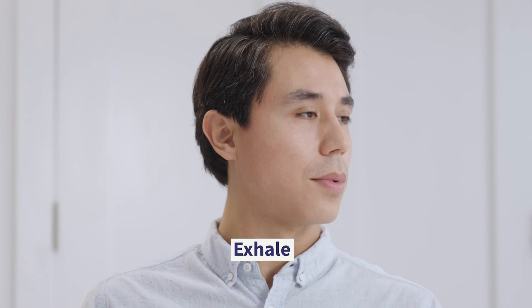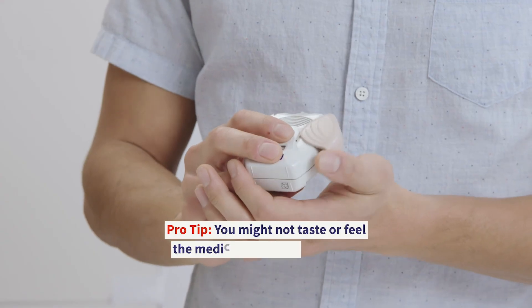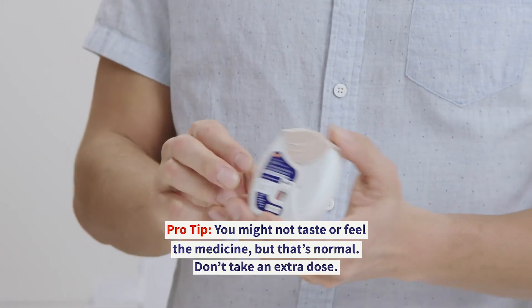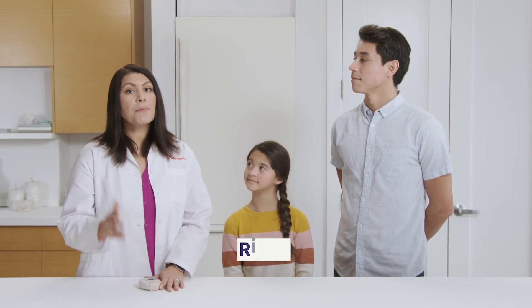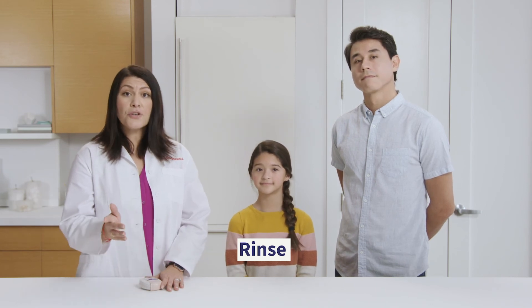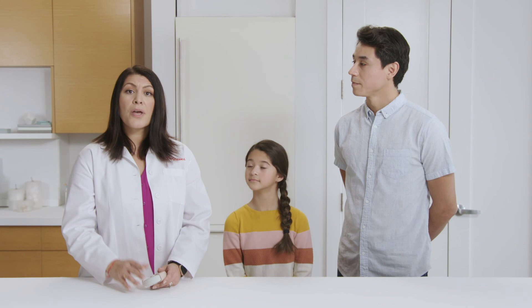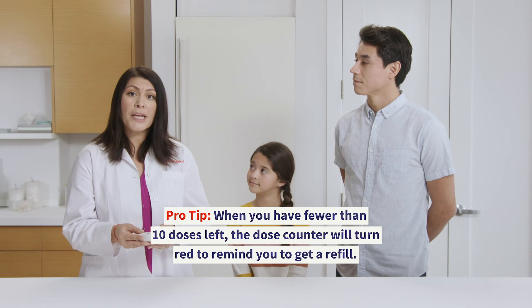Next, exhale slowly and gently with your face pointing away from the Ellipta. Then slide the cover up and over the mouthpiece. If your Ellipta contains a steroid, be sure to rinse your mouth with water after each dose — just don't swallow the water. Replace your Ellipta as needed. Remember to write the tray opened and discard-by date on the Ellipta's label when you first open it, in accordance with package instructions. Also, be sure to check the dose counter for the number of doses remaining, which will tell you when you're running low.